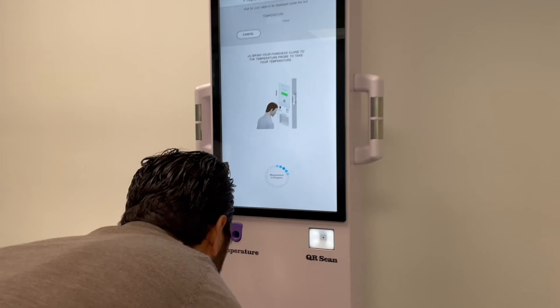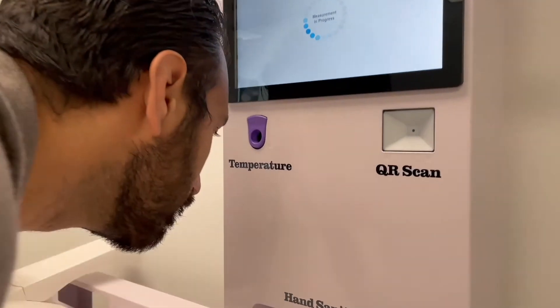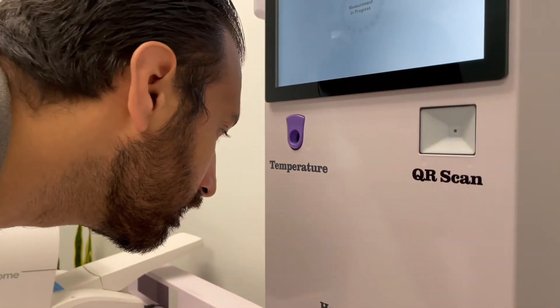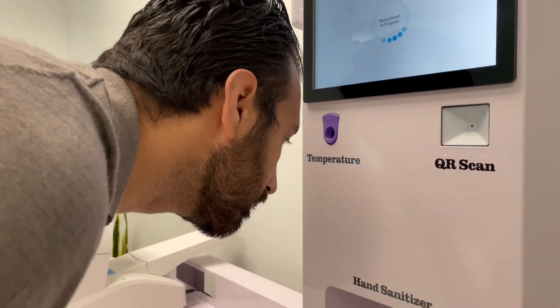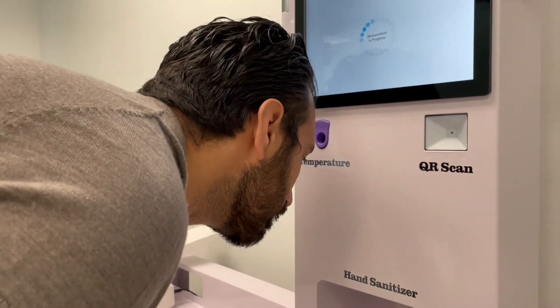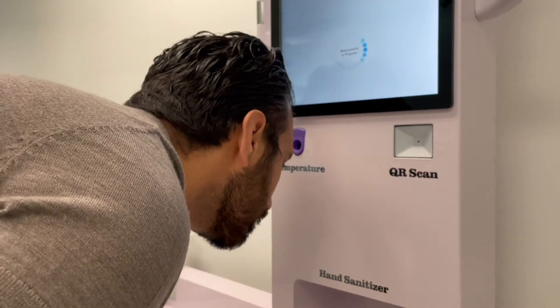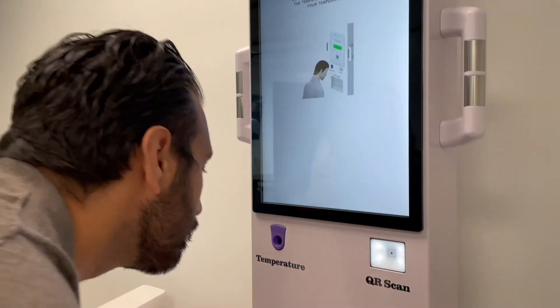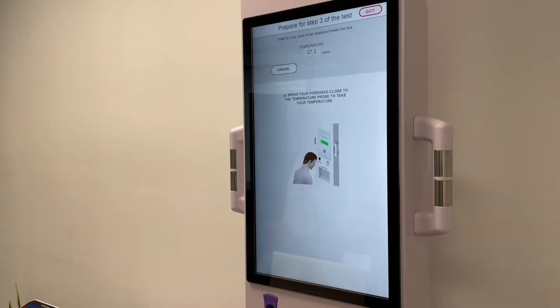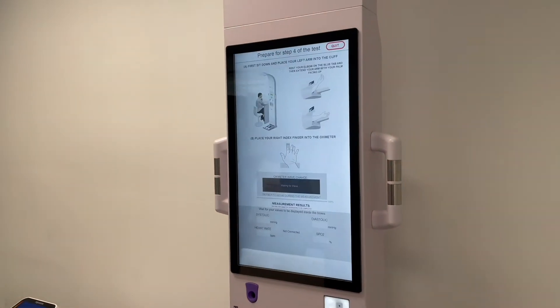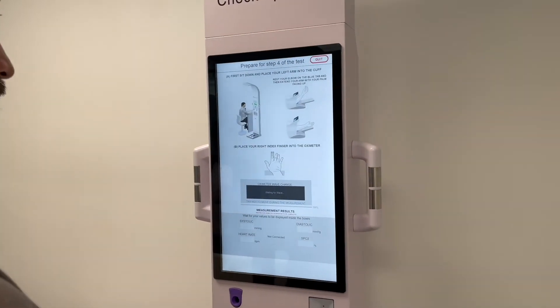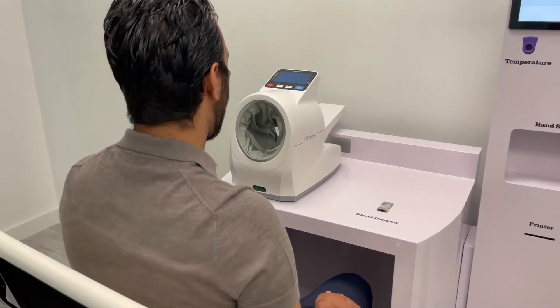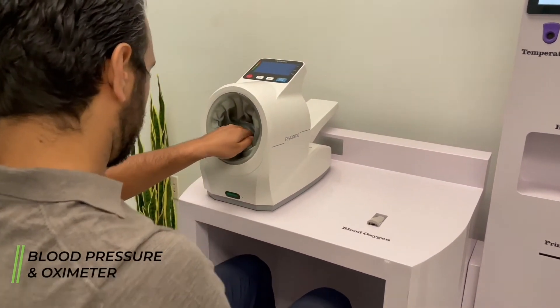Phase three of the exam: temperature measurement. Press the start button, then bring your forehead within three inches of the temperature sensor and wait for the measurement to be taken. The measurement is complete.